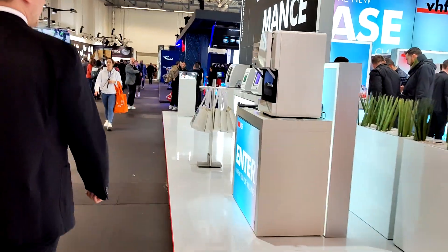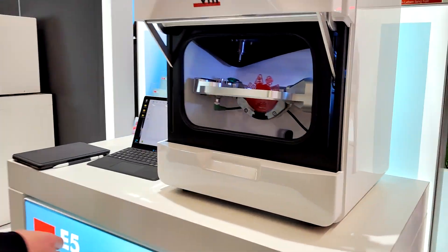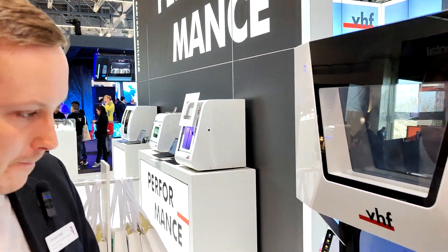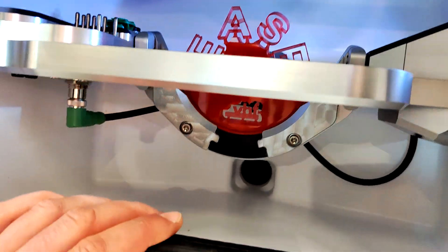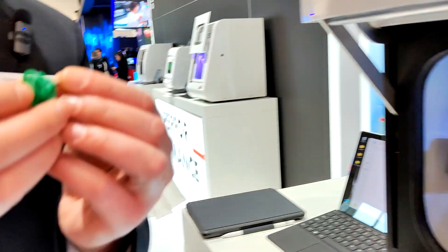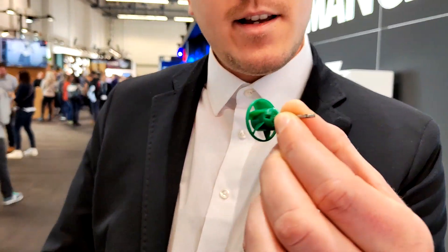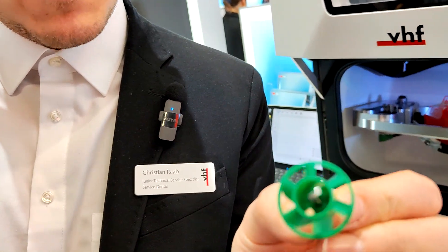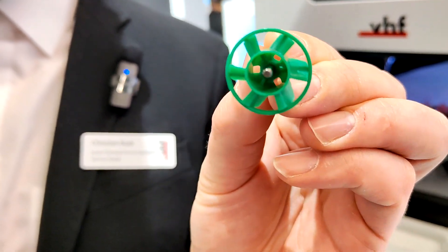Back to the E5: it features a C-clamp design enabling horizontal milling for front teeth processing. As for the compressed air question — VHF invented something totally new called the air tool. They developed a turbine and put it on the tool itself. The spindle turns at 30,000 RPM and blows away the dust, eliminating the need for any compressed air.